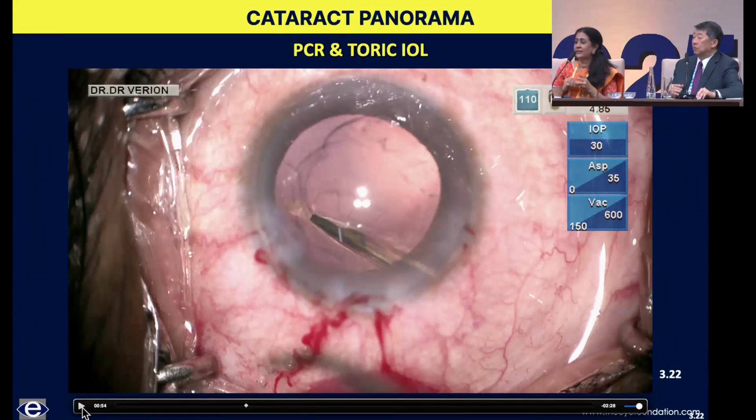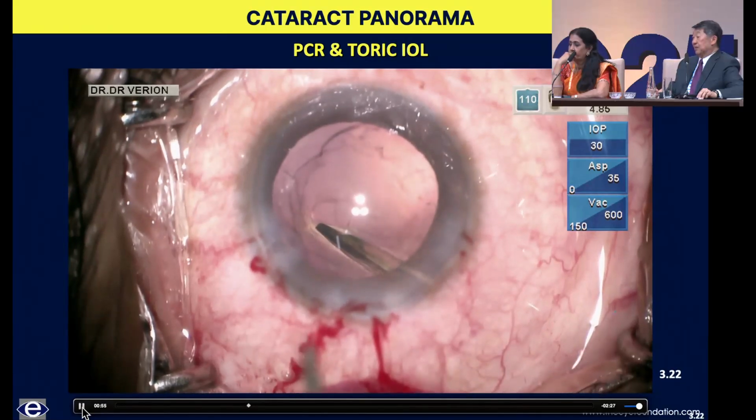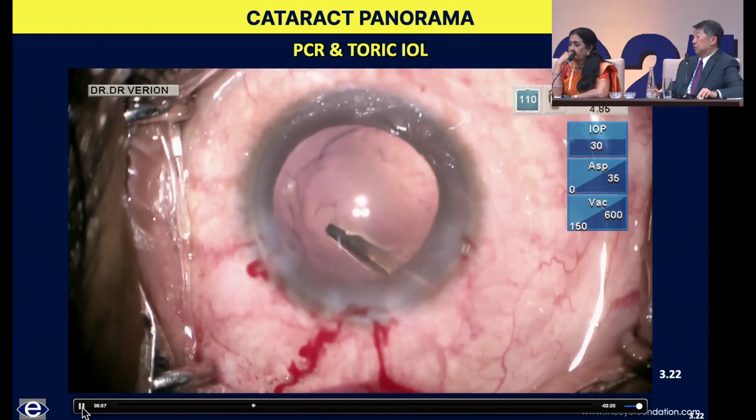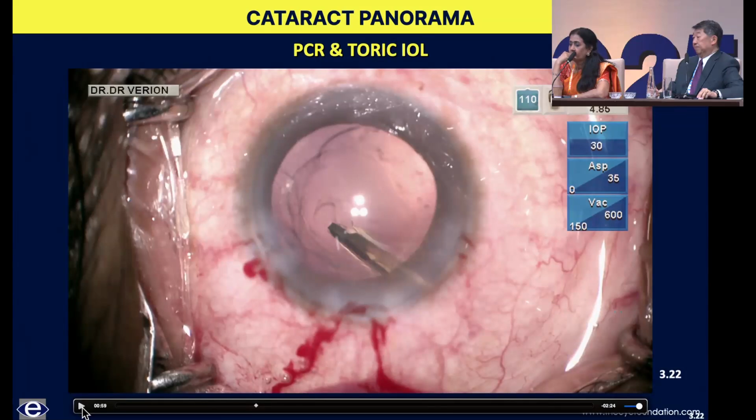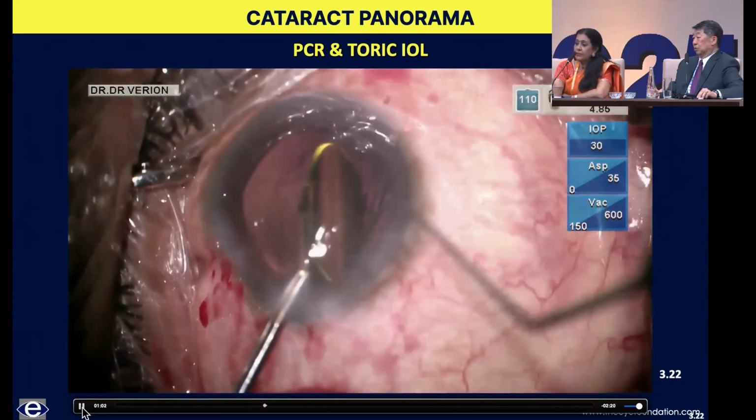All right, you're going to have to probably clean that up first. You don't want to be positioning and monkeying around with the lens while the vitreous is wrapped around that. So I'd probably take it out and do the vitrectomy and then consider reverse optic capture if you want. But for a reverse optic capture, there has to be space in the bag.